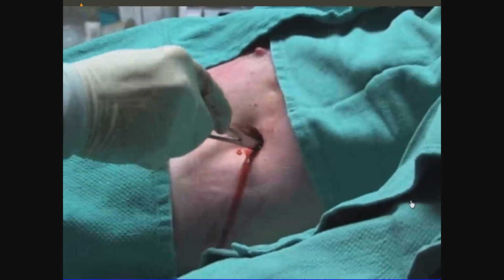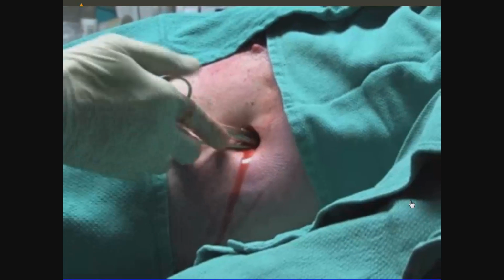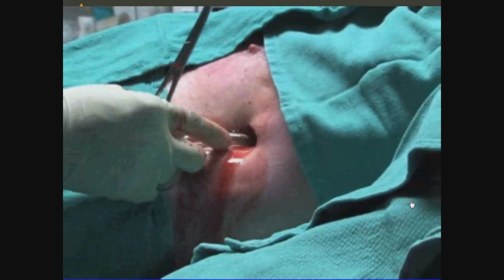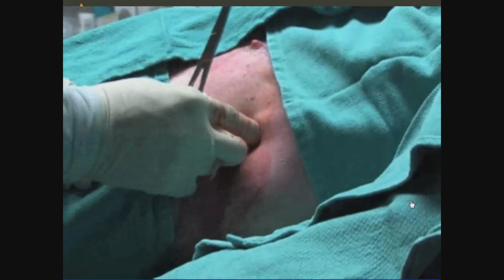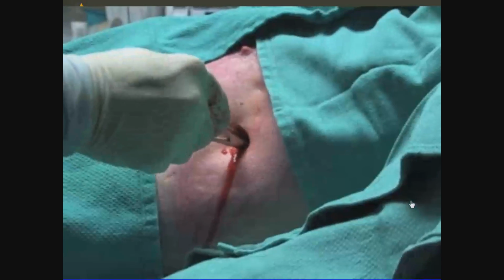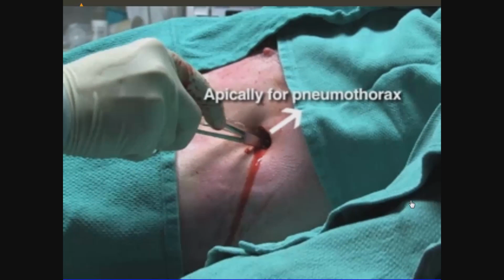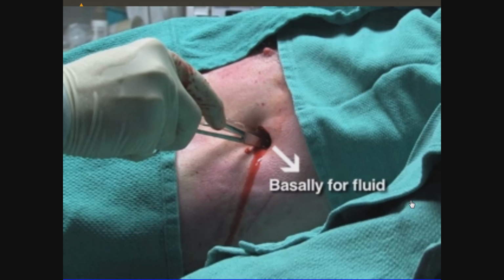Pass the tube through the incision, unclamp the jaws of the Kelly, and then direct the tube through the tract slowly using the finger as a guide. If the tube is meant to evacuate a pneumothorax, aim it apically towards the top of the lung. If the indication is to drain fluid, aim it basally towards the bottom of the lung.